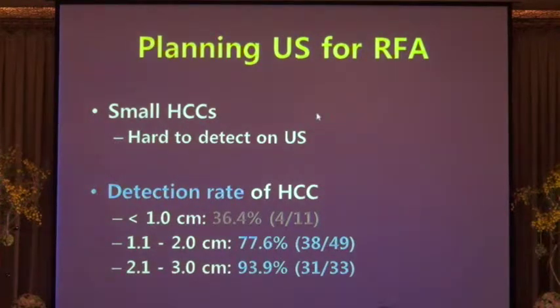Small-sized HCCs are not easy to detect on ultrasound. In this study, even though plain ultrasound for RFA was performed by radiologists who were aware of the size and location of the tumor, the detection rate of small HCCs was much lower than expected. Therefore, we have a hard time ablating these small tumors under ultrasound guidance. This is why fusion imaging is needed.